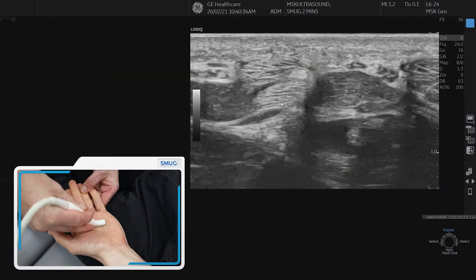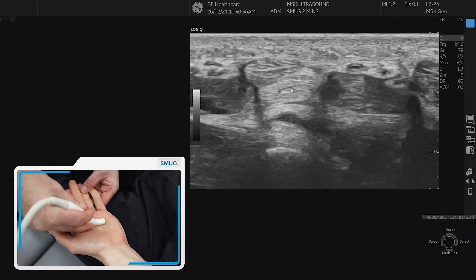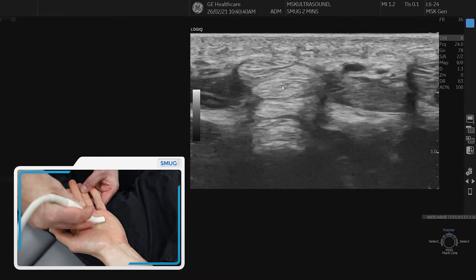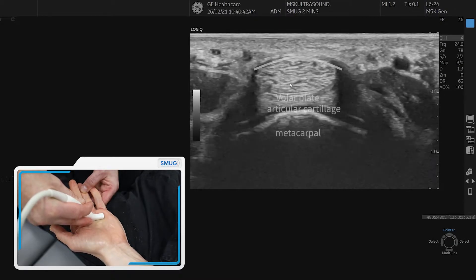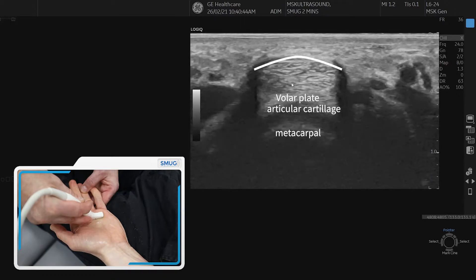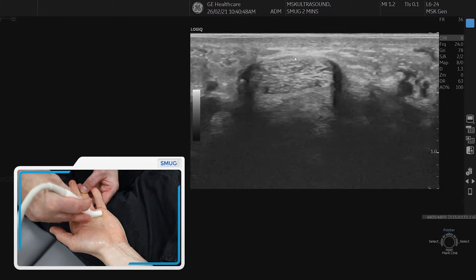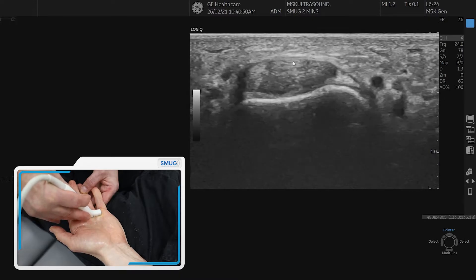We're going to start showing you the transverse approach for the flexor tendons. The profundus and the digitorum superficialis are visible here just proximal to the MCP, so we're going to trace it to the level of the MCP. At that point you see the A1 pulley on top, and we continue to go distally.